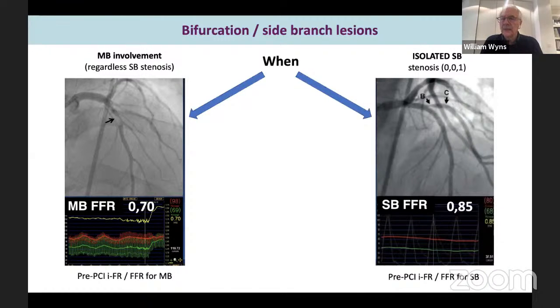It is elliptical. And that explains why the dimension is large enough to allow a preserved FFR. Okay, so it is an issue of proper angiographic projection that explains why you have a preserved FFR here. In another view, it would appear normal. And this phenomenon is more apparent with a smaller angle.